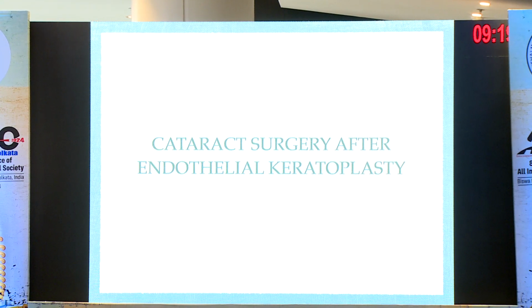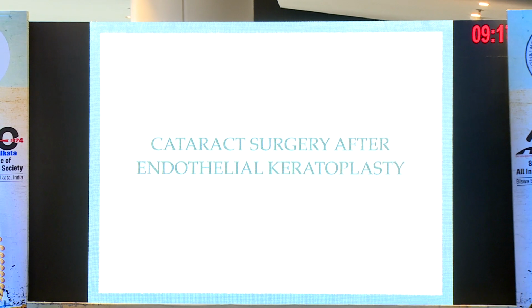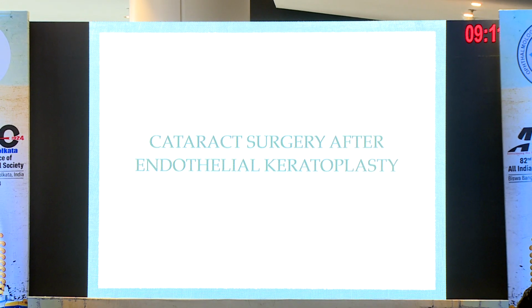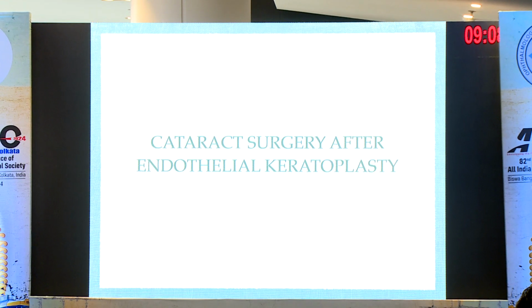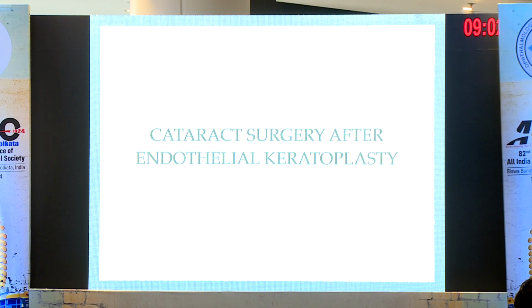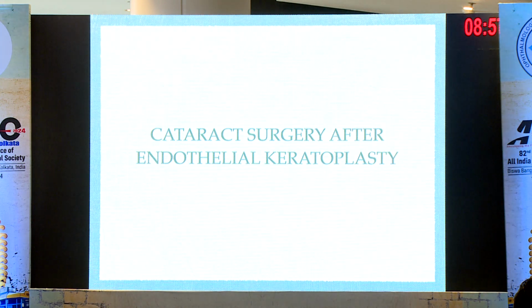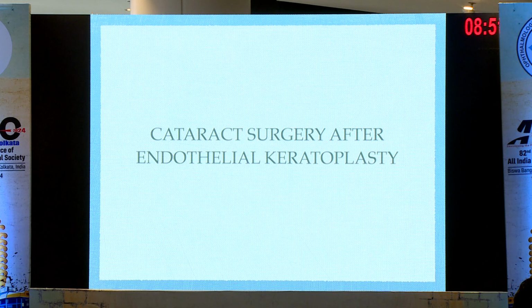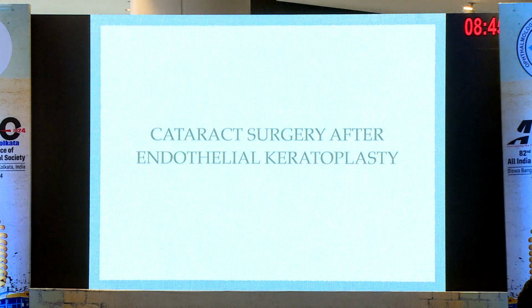The first situation is cataract surgery after an endothelial keratoplasty, so either the patient has had a DSEK or a DMEK. If the patient has had a previous DMEK, the surgery is pretty much just like it would be in a virgin cornea. You don't really have to do anything separate, except that your endothelium is precious, so you want to preserve it. The approach to your cataract surgery will be like it is for any patient with an endothelial deficiency like Fuchs. So you will probably use a soft shell technique or a viscoadaptive OVD to protect the endothelium, and repeated injections of OVD in between your steps of cataract surgery.